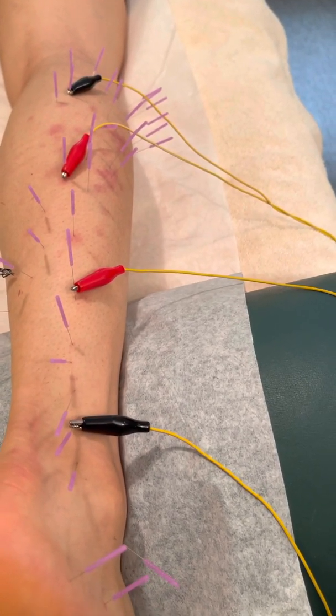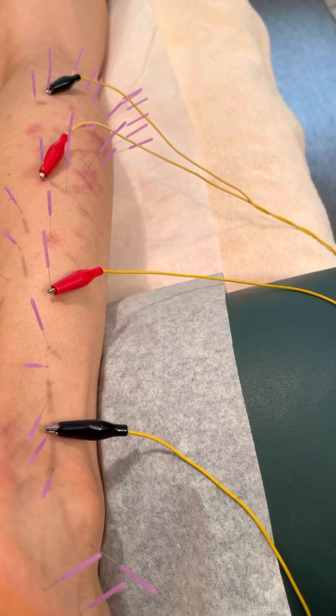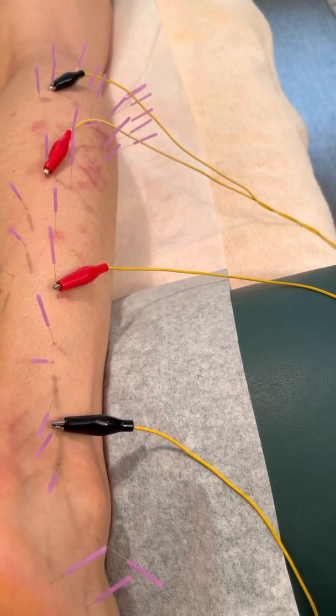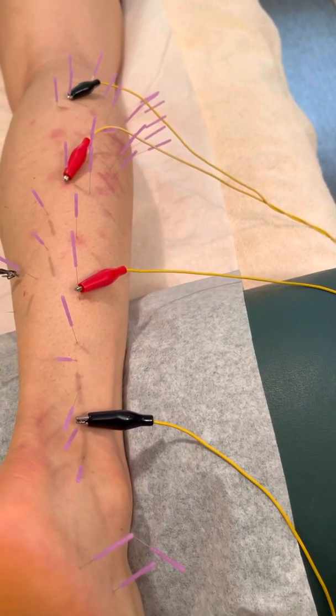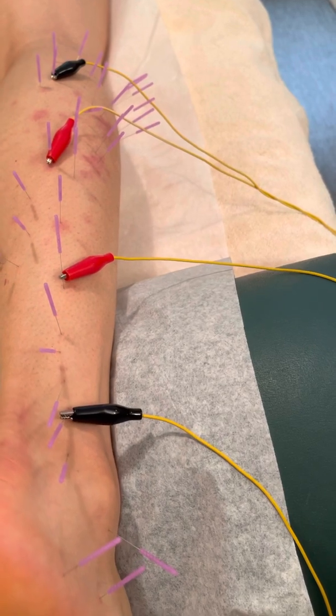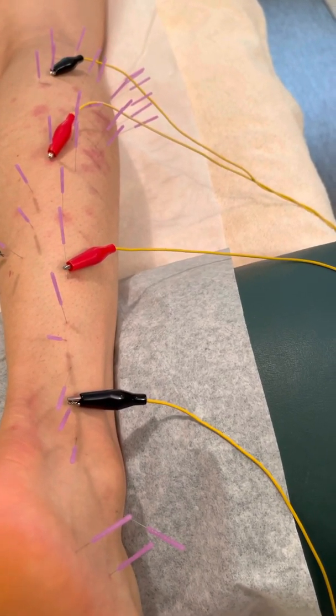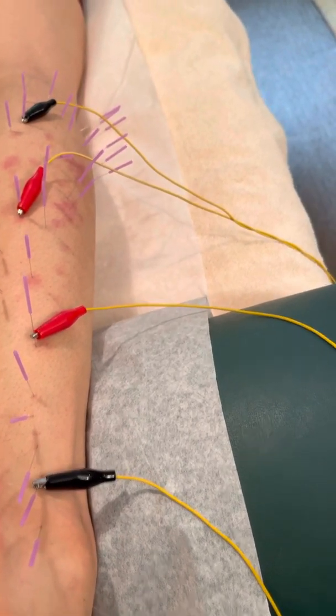And so the dial isn't as high as it was before. Is it still too much? Just a little bit. Okay, let me lower it again. And you'll notice that she's laughing. That's good. I'm a psychopath. Yeah, I'm going to do the lowest one. Oh, that is the lower one. Okay. That's good. You feel it in all the areas? Is that enough?